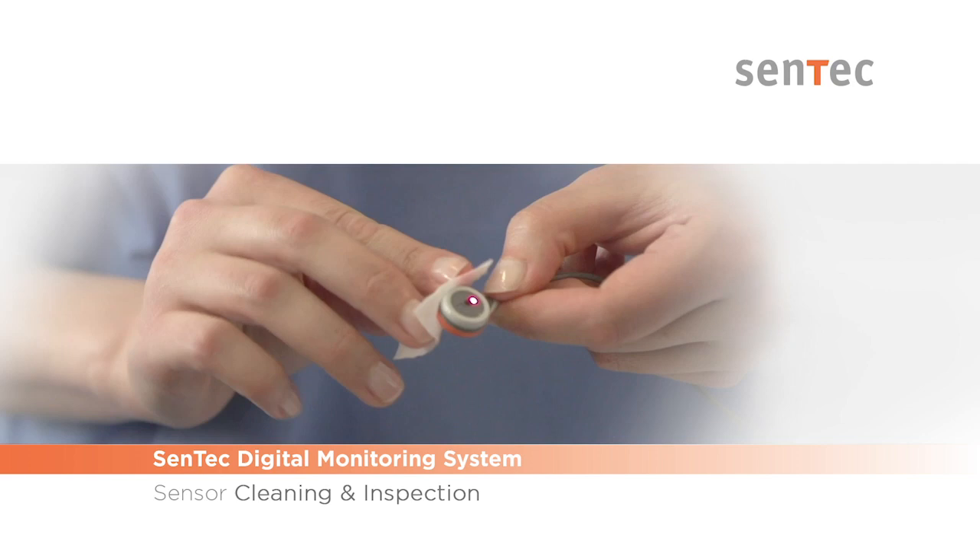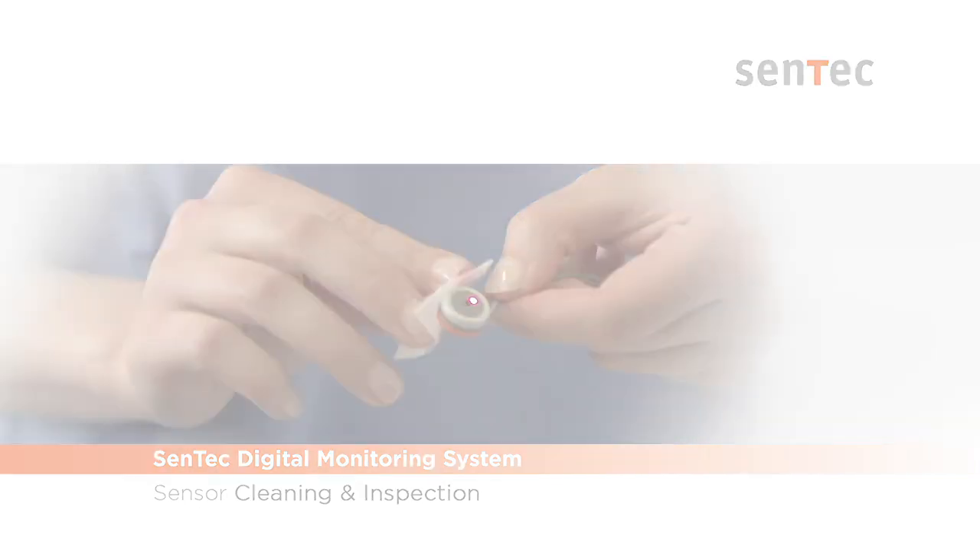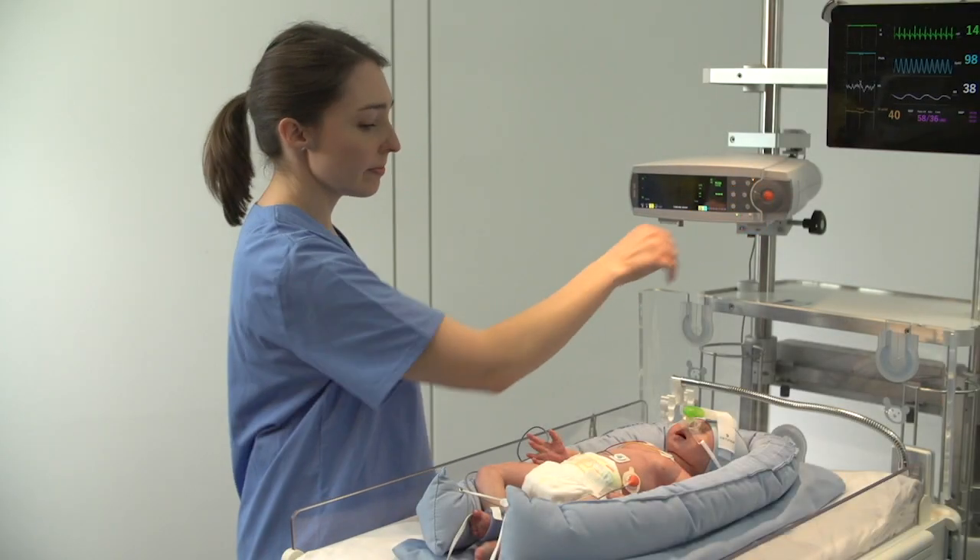This video will demonstrate the basic cleaning and visual inspection steps necessary to keep the Sentex sensor in good working condition. Follow these steps between each monitoring period.